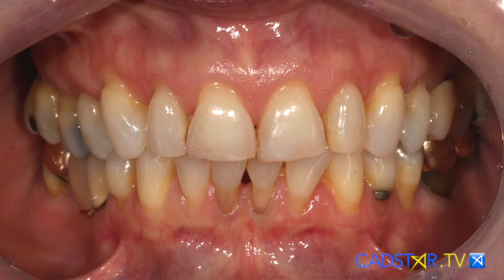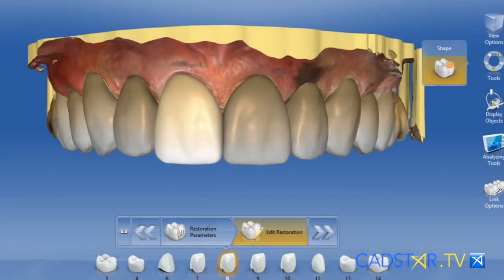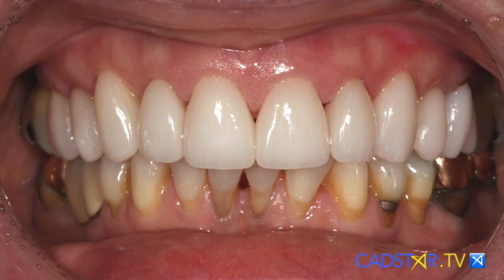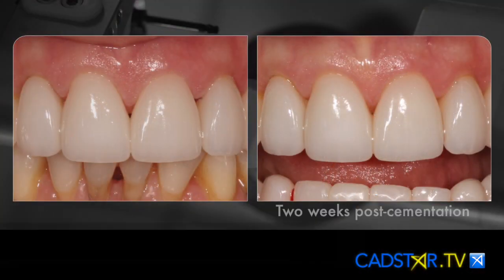So I'm going to go through the basic steps I use to set my midline in the virtual design software. So when it mills, these restorations drop in, you don't have to adjust the interproximal zone, and it really makes mastering the midline easy. So let's go through that process together.